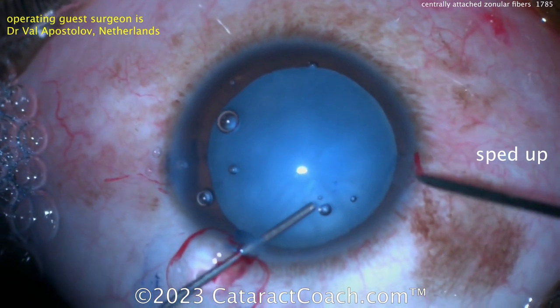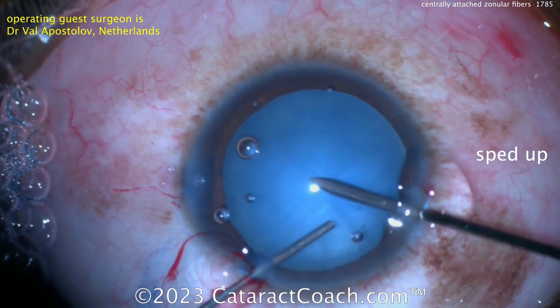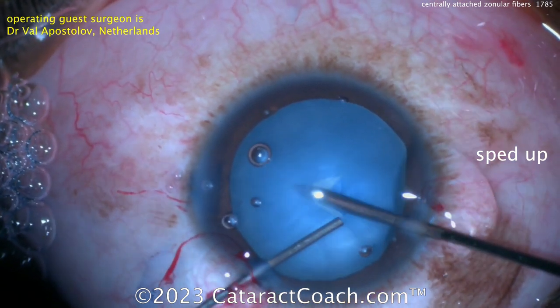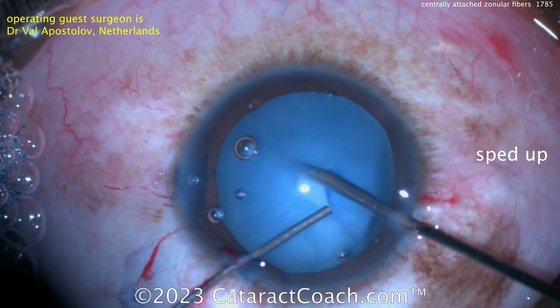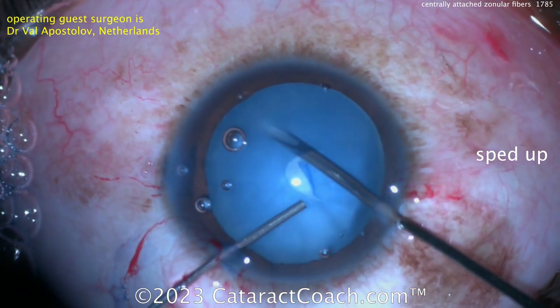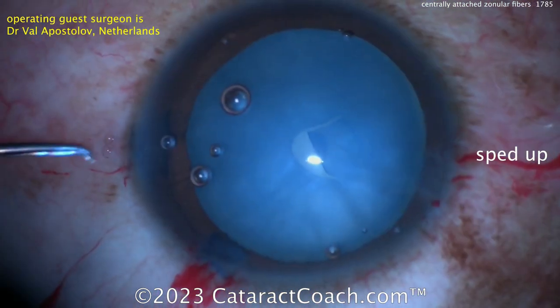Let's see what's going to happen here. Going in, injecting viscoelastic with the left hand while the right hand does a needle decompression — smart move. Double duty there. Look at that needle decompression, aspirating with that needle while the left hand is injecting viscoelastic to keep that AC pressurized. Smart move.